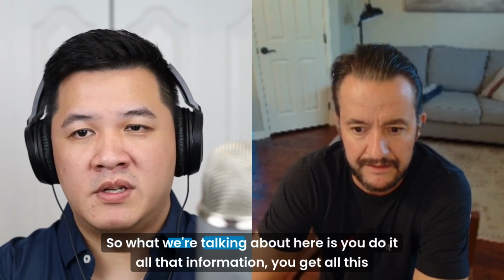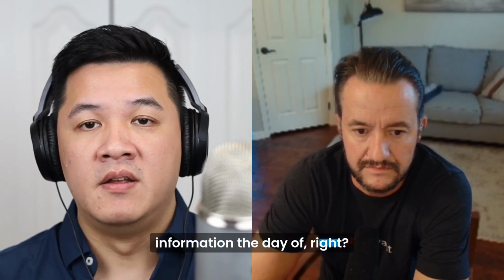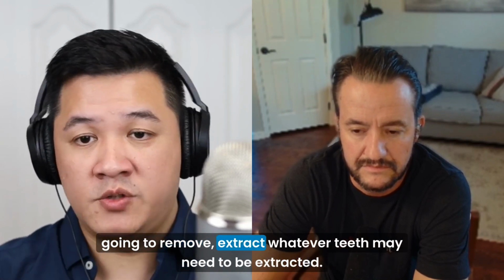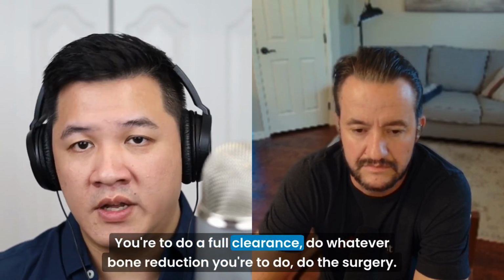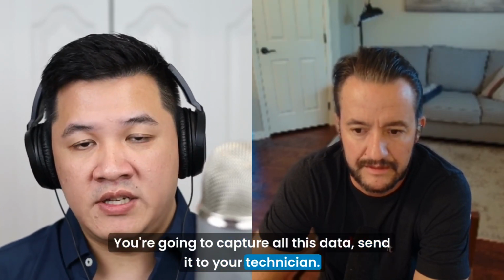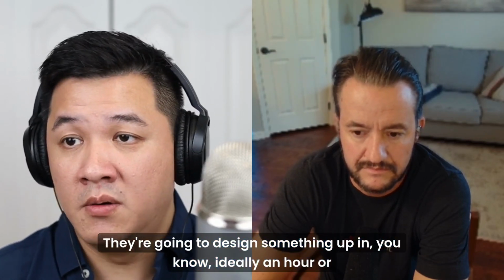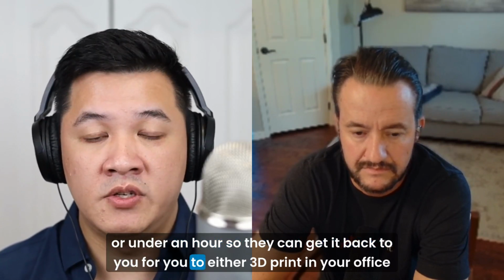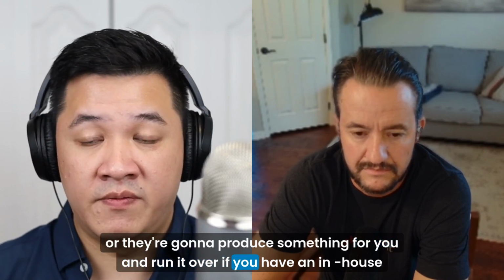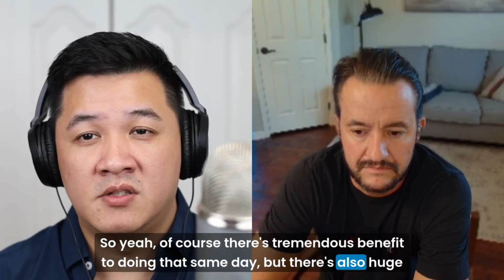Absolutely. What we're talking about here is you get all this information the day of, right? On the clinical side, you're going to go in there and extract whatever teeth need to be extracted. You're going to do a full clearance, do whatever bone reduction you're going to do for the surgery. You're going to capture all this data and send it to your technician. They're going to design something up in ideally an hour or under an hour, so they can get it back to you to either 3D print in your office, or they're going to produce something for you and run it over if you have an in-house technician. So of course, there's tremendous benefit to doing that same day, but there's also huge drawbacks.